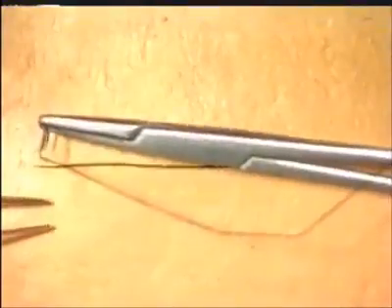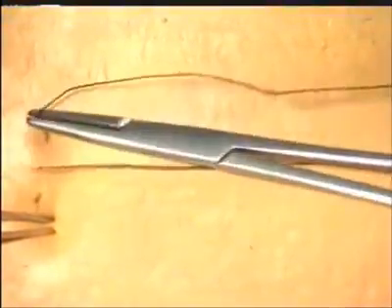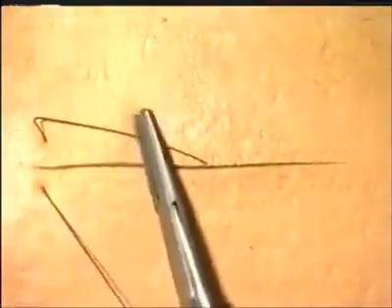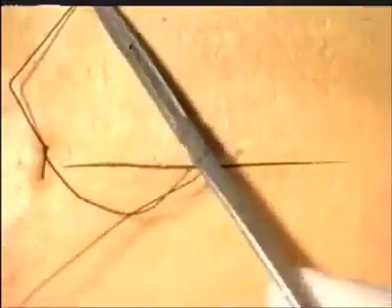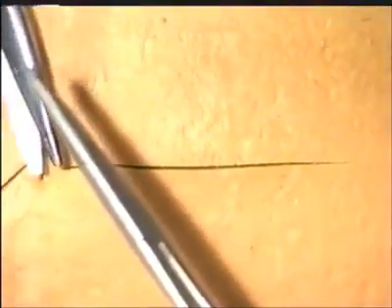We are now going to close the same incision using a continuous suture technique. Insert the first suture as before at right angles to the skin edge, and ligate this using a standard reef knot. However, in this situation, just cut the short end, and hand the long end of the suture to your assistant, who will follow you during this procedure.